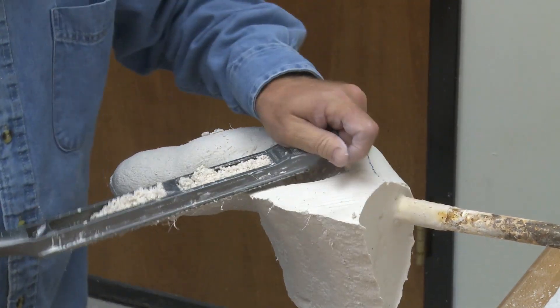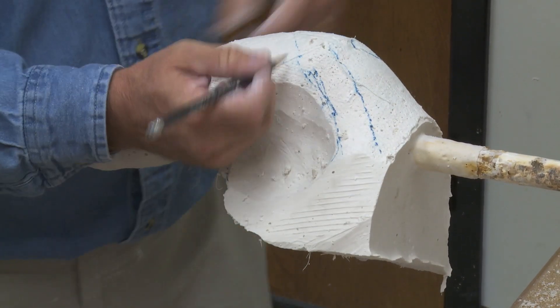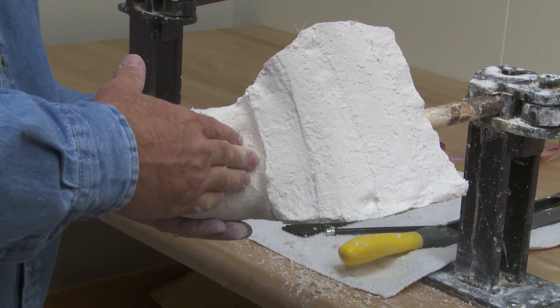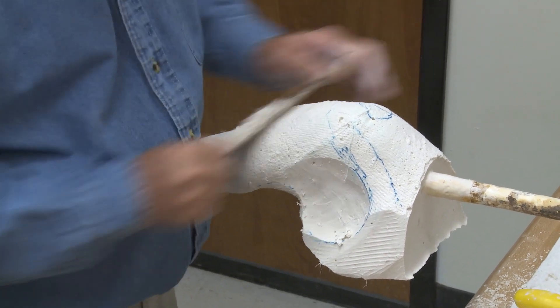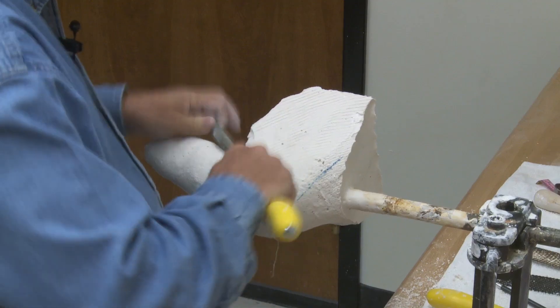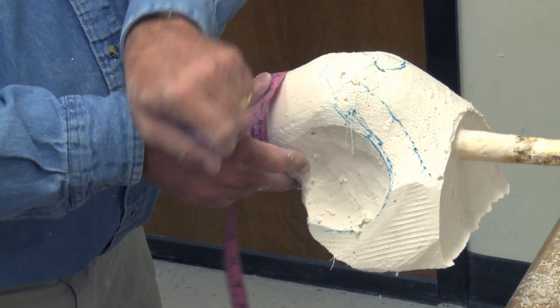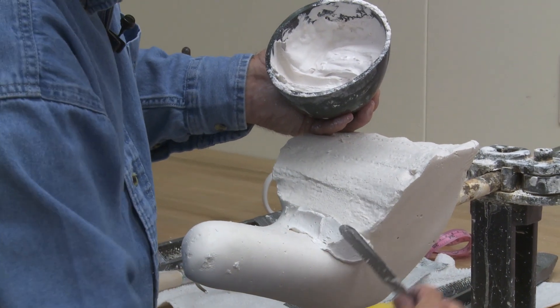As you modify down to this AP measurement, remove plaster at the anterior trim line to prevent a large wing. As you remove this plaster, re-establish the trim line. Looking at the medial aspect of the model, note the W shape and accentuate this shape. Establish the ML measurement and modify the model down to that measurement. In a case where the patient has a large amount of soft tissue, leave this dimension slightly larger than the measured amount, as the socket can be very difficult to doff if it is too tight. But if this dimension is too loose, abduction of the humerus will not translate to the prosthesis. Measure circumferences. Areas over the electrode sites may be accentuated for improved electrode contact. Smooth the entire model. Fill any fingerprints in the axilla and accentuate the pectoralis tendon and latissimus dorsi.